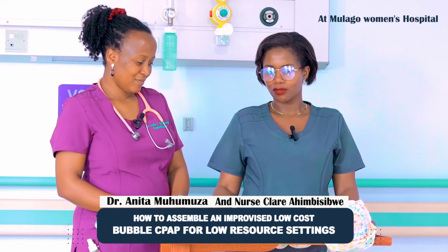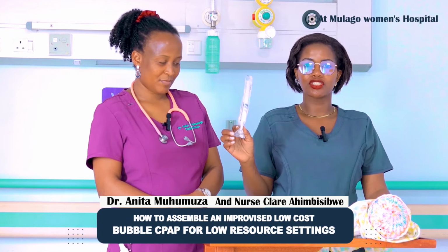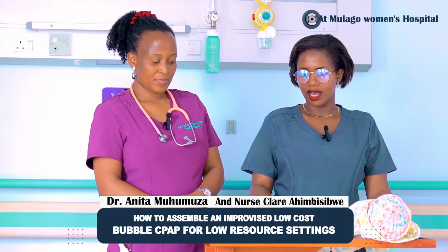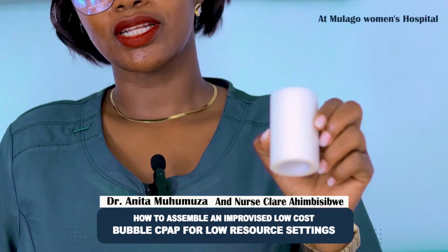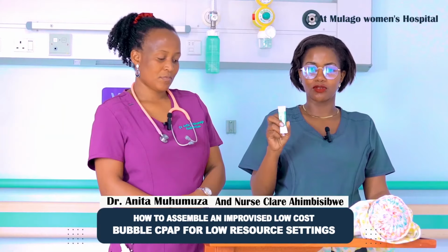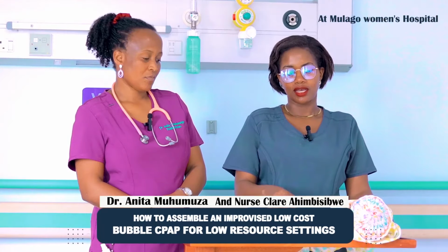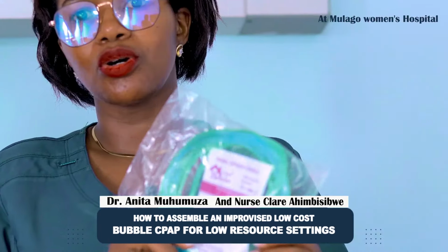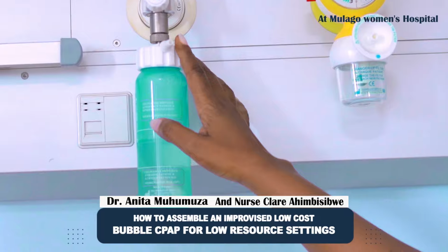Let me take you through the equipment. The equipment we need for this bubble CPAP is a 10 ml syringe or a 20 ml syringe, whichever is available, a disposable infusion set, then a sterile bottle or normal saline bottle with distilled water. Then we have a transparent tape or any other plaster can work. Then we have the surgical blade that we shall use for cutting, and the tape measure. In case you don't have a tape measure, you can get a ruler and measure your centimeters on a paper, which we use to attach on the bottle. And then we have the nasal oxygen cannula. We have our baby for demonstrating, and definitely we need the oxygen source.